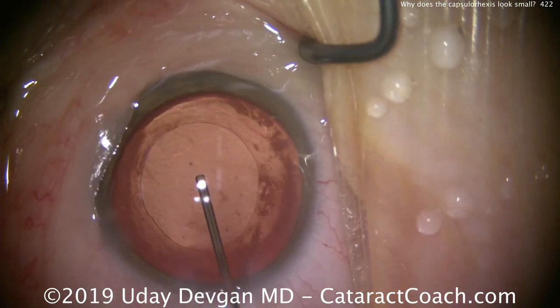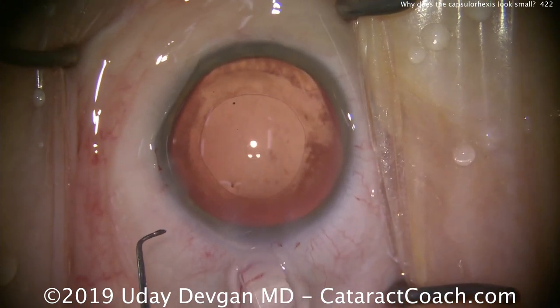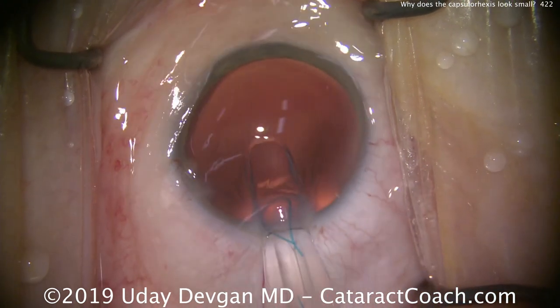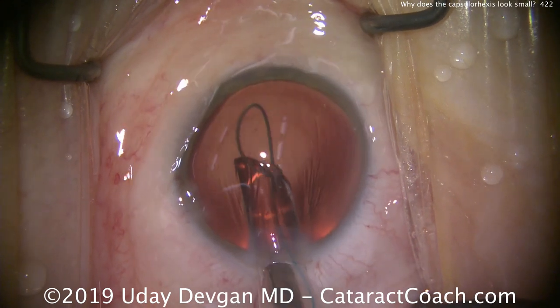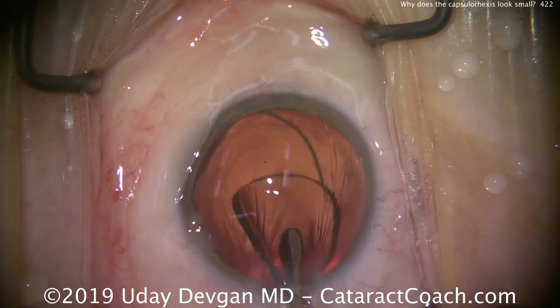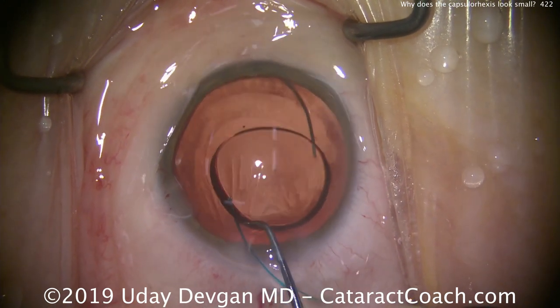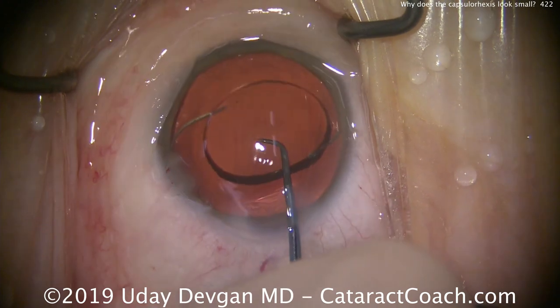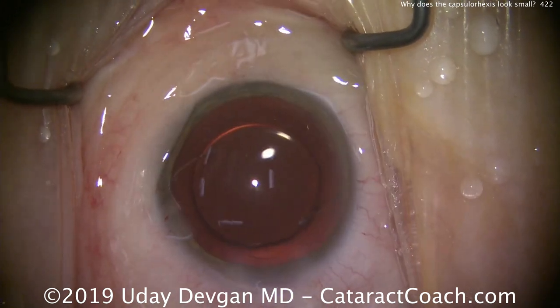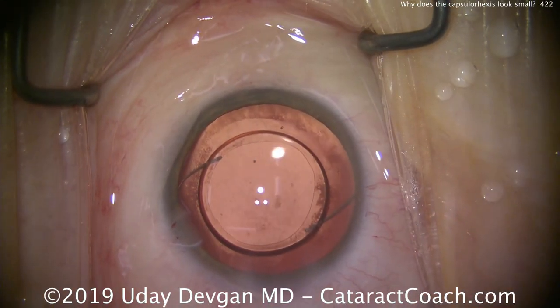Fill in the capsule bag with cohesive viscoelastic — you can see the outline of the capsulorrhexis; it looks really good. Let's put the lens inside. This is a three-piece acrylic lens with a very small dioptric power. Nice and easy, get that leading haptic in — it opens up just beautifully. There's the optic, and the trailing haptic dials into the bag as well. Once we get this lens in the capsule bag and centered up, that's a really nice overlap — the rhexis is overlapping the optic just beautifully. Lens looks very nicely centered.